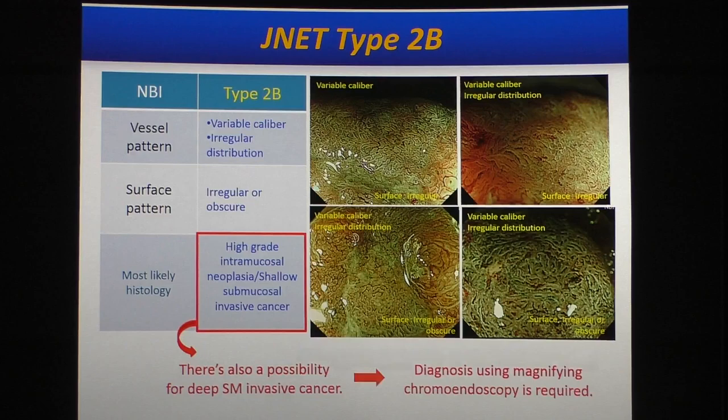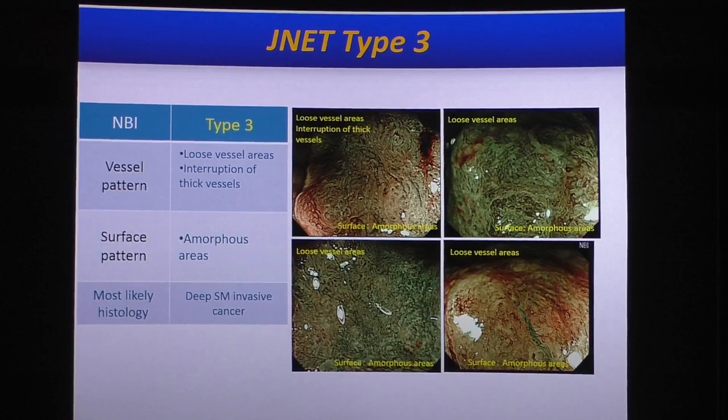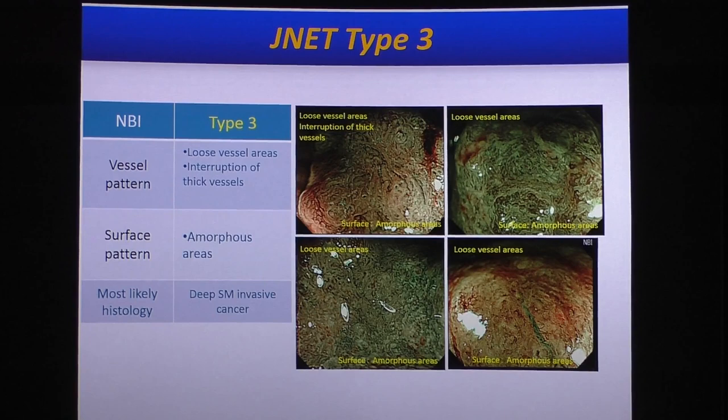If you can see loose vessel areas — sparse vessel patterns and amorphous areas — the lesion is classified as JNET type 3. JNET type 3, with high confidence, indicates deep submucosal invasive cancer requiring surgical treatment. So in this case, even without crystal violet staining, we can diagnose this lesion as deep submucosal invasive cancer.